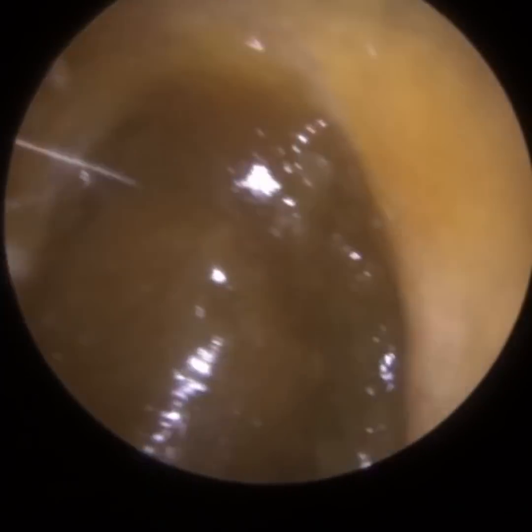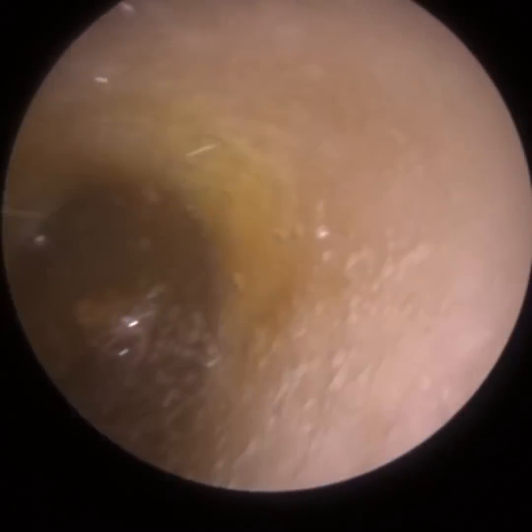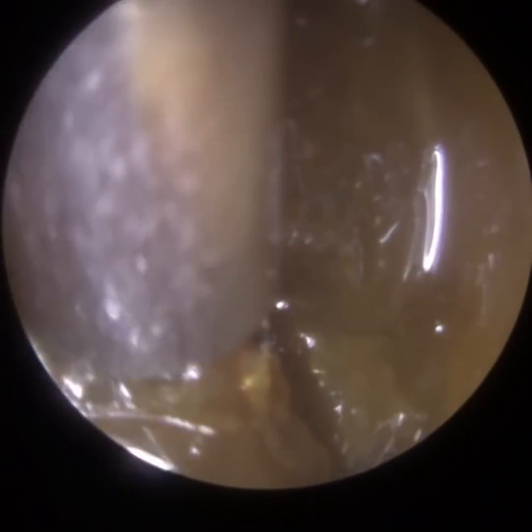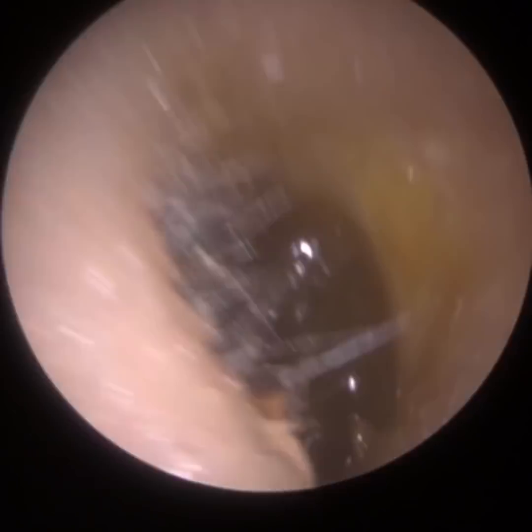In this video, I have a couple of patients who attended with bilateral, very wet, sticky, glutinous earwax, which is very hard to suction. Therefore, in both instances, I instill some olive oil earwax spray. What the olive oil does in cases like this is change the consistency of the wax. It makes it more suction friendly, if you like.